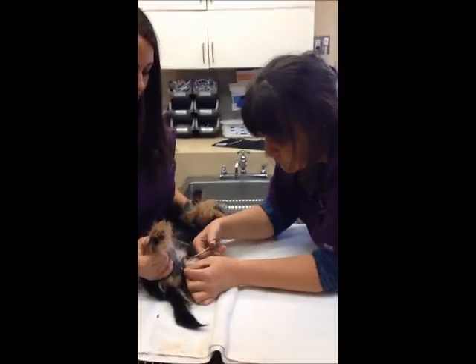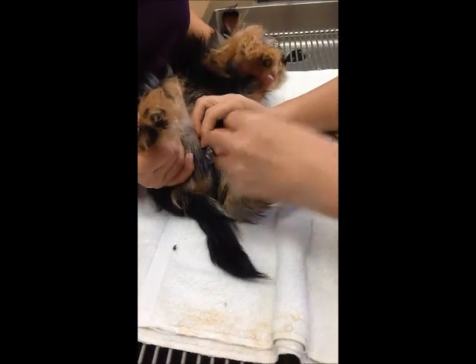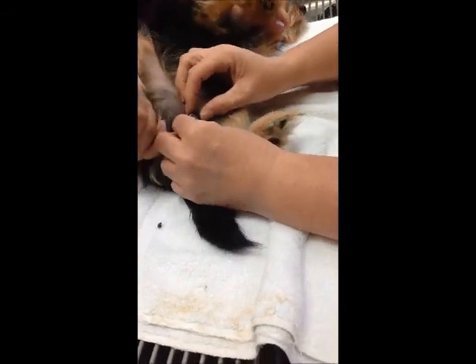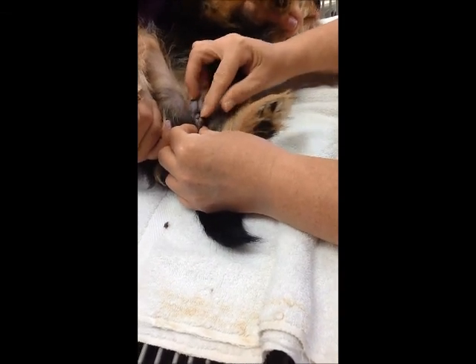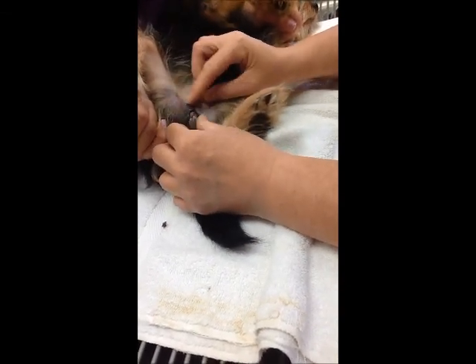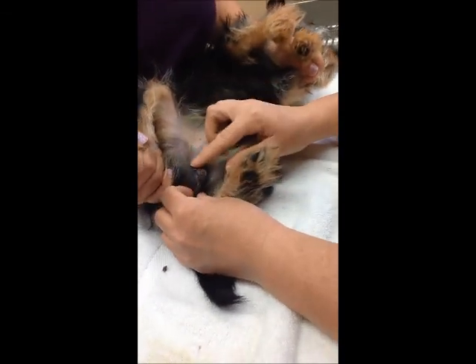I'm just going to pull the suture forward and remove it. There was a little scab on his incision site, so that'll heal up nicely. I'll have them put a little Neosporin on it, but you can see that it healed very nicely and looks very good otherwise.